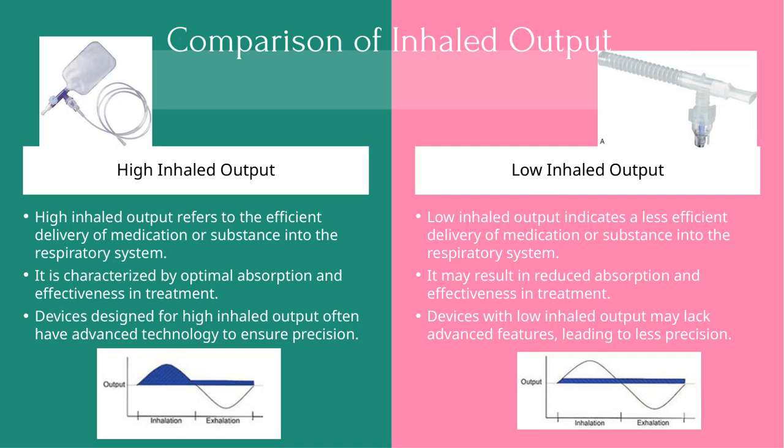Let's talk about high inhaled output first. This refers to how efficiently a device delivers medication or substances into the respiratory system. When the inhaled output is high, it means that the medication is being effectively absorbed and can work more effectively in treatment.